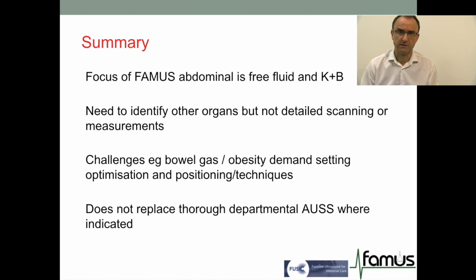We are supposed to identify other organs, but not to report on these other organs. There are challenges to our ultrasound imaging of the abdomen, which is mainly the presence of gas that constitutes a physical barrier for the ultrasound beam, but also the non-ideal condition in which an acute patient presents to our care.